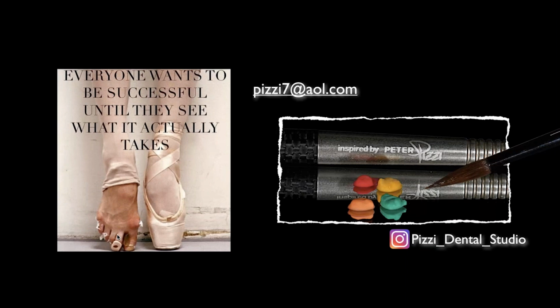All right, that kind of leads into another question. What materials or rubber wheels do you use? And you just mentioned some Dialite wheels. Anything else on that? Yeah, I'm using the Dialite polishes. There's three of them. The yellow one's kind of my favorite. There's a blue and a red and a green, I think, and each of them has a different amount of coarseness. I tend to finish most with the yellow one that I'm using most of the time, but I do change that up every now and then. If I want a lower luster or a higher luster, the finer the polish, the higher the luster. The rougher the polish, the lower the luster.